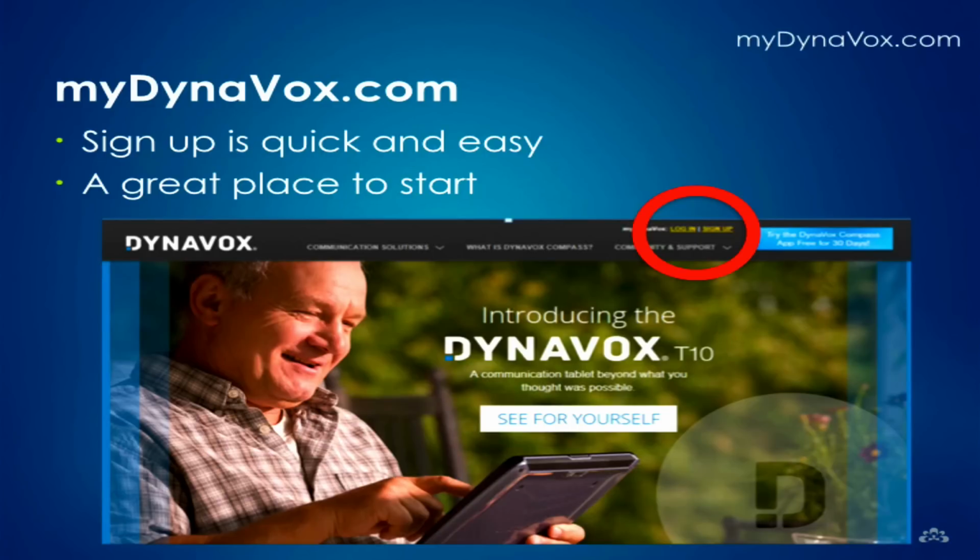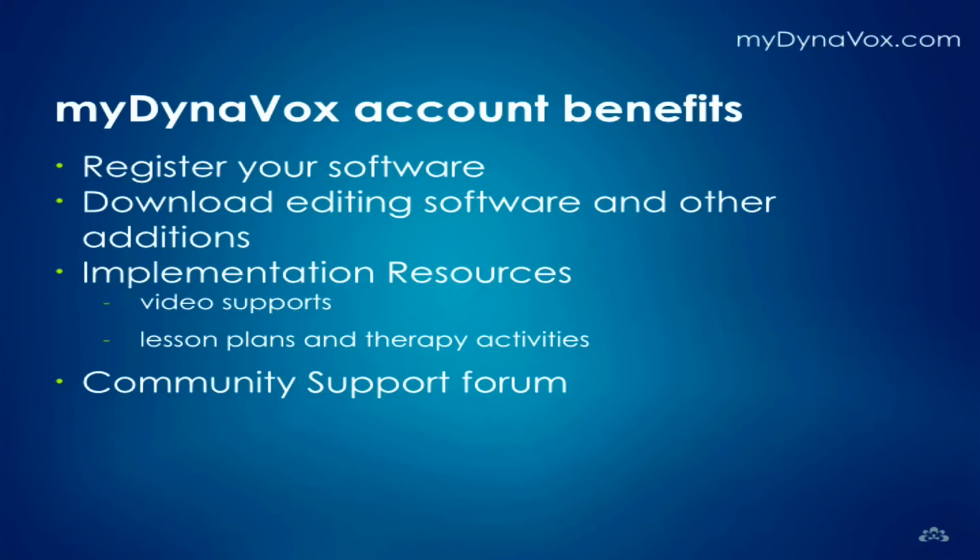So it's a good place to start, to head on over to MyDynavox.com, sign up and see what's there already. Some of the things that you can access through that account are being able to register your software, the Compass app, and you will need to do that at some point on your device, whether it's on the T10 or on your iPad, because any time that you want to back up those pages to the cloud to keep them there for safe storage or to share with other people, therapists, you do need to have registered and sign in with that account to do that.